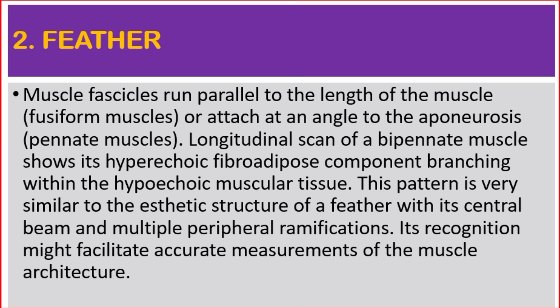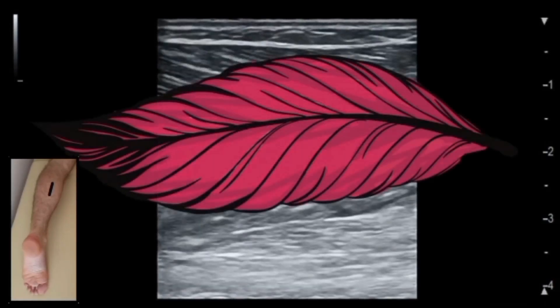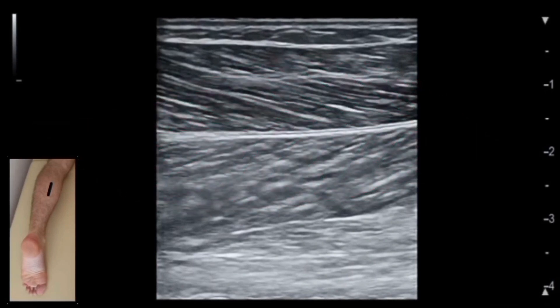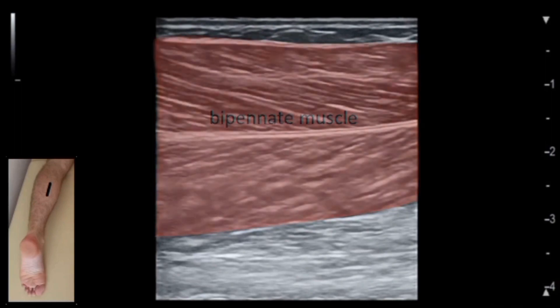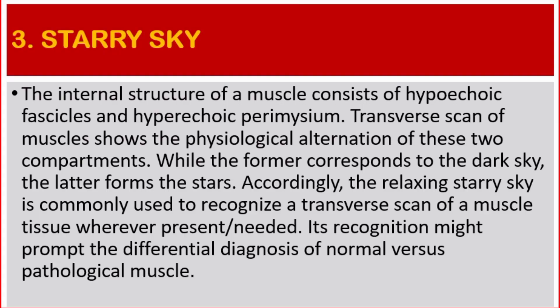Its recognition might facilitate accurate measurements of the muscle architecture. Number three: starry sky. The internal structure of a muscle consists of hypoechoic fascicles and hyperechoic perimysium. Transverse scan of muscles shows the physiological alternation of these two compartments — the former corresponds to the dark sky, the latter forms the stars. Accordingly, the relaxing starry sky is commonly used to recognize a transverse scan of muscle tissue. Its recognition might promote the differential diagnosis of normal versus pathological muscle.